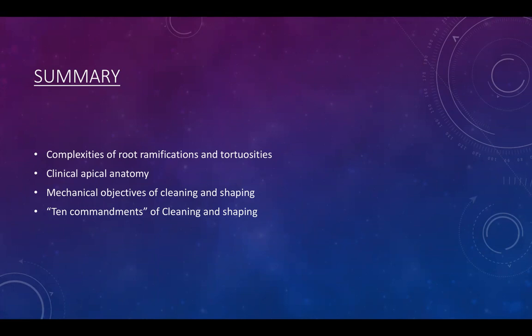If you see that you have a very natural large canal in mesial and a very natural large canal in distal, that might be a sign that you only have two. But I will always prefer, after preparation, having either a cone or a file in an angled x-ray, if we don't have a CBCT scan available at that moment. That does make sense.